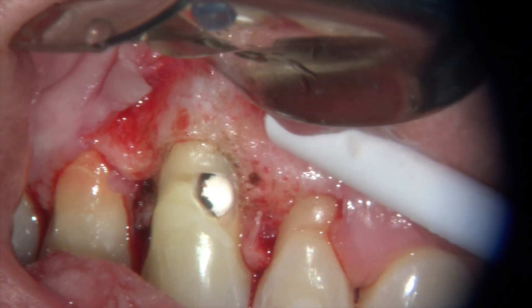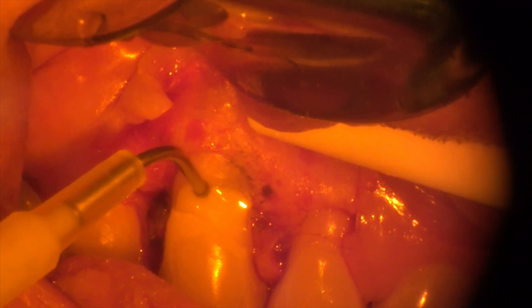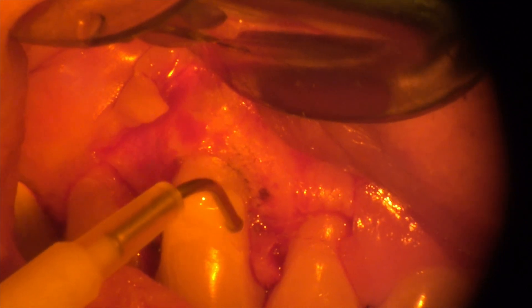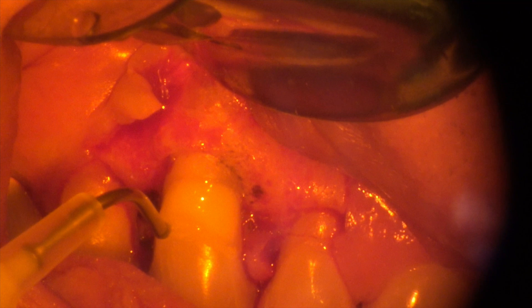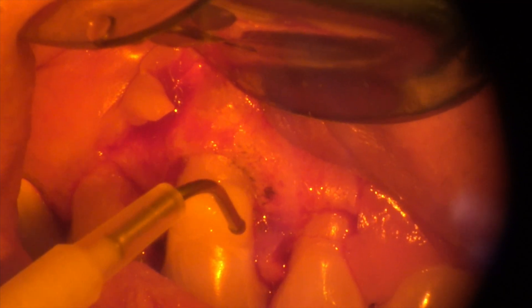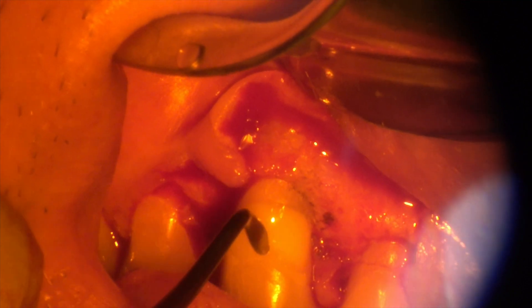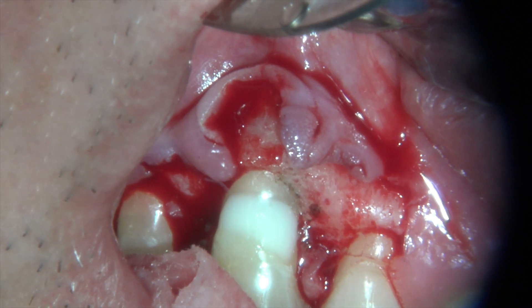After etching and drying, the tooth-colored BC liner is applied — it comes in two shades. The blue version is used 98–99% of the time for better contrast, but for aesthetic reasons you obviously don't use blue BC liner on the cervical area of a canine. You must wait about 30 seconds using an orange filter so the light doesn't cause premature setting, allowing the self-etching and self-bonding to take place before light curing. If you light cure too quickly, you get no bonding and too rapid polymerization shrinkage that prevents proper etching and bonding.